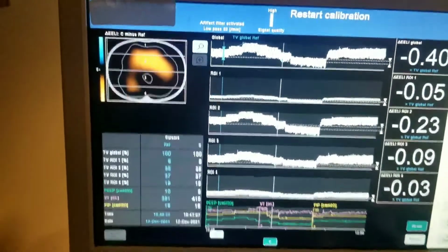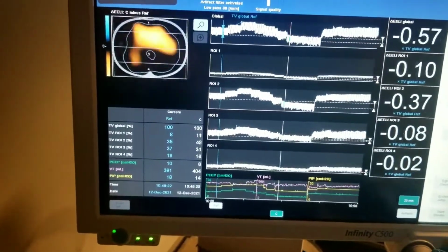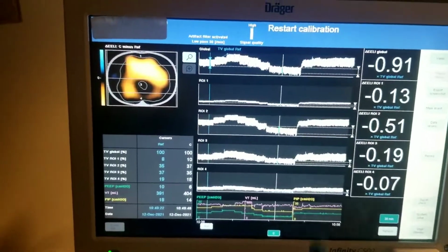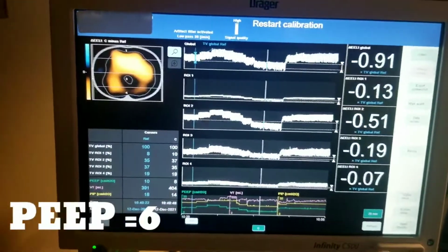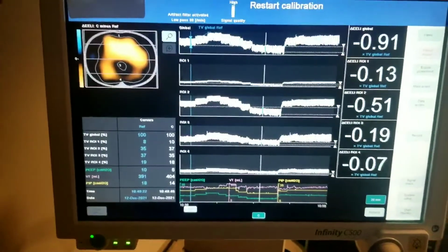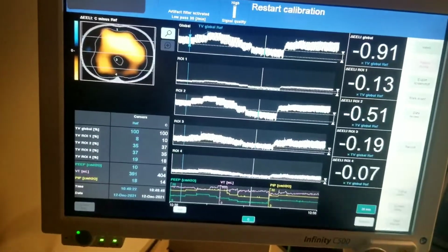But as you drop it below here, now you see that there is a loss starting in the ventral areas, and then after that you see it becoming a significant decrease in end expiratory volume, which translates and makes sense with the decreasing impedance curves here, as well as with the PEEP study also. So, various ways of looking at the same information in a way.